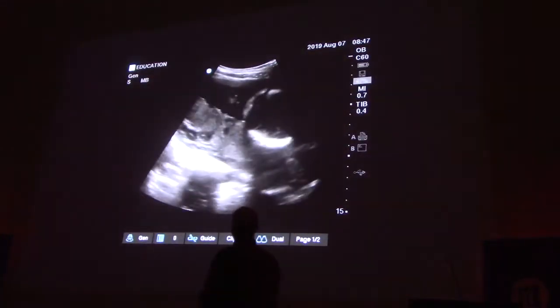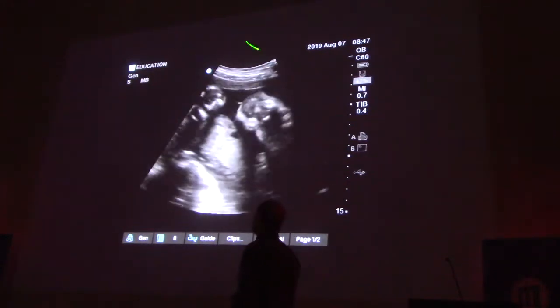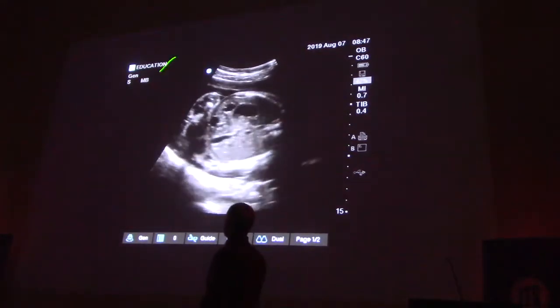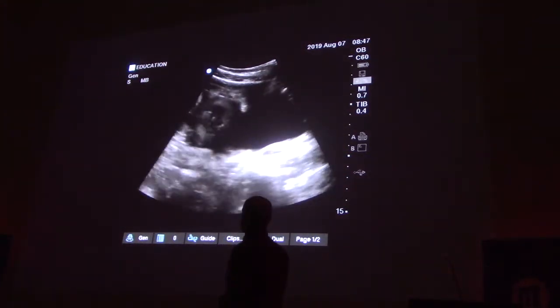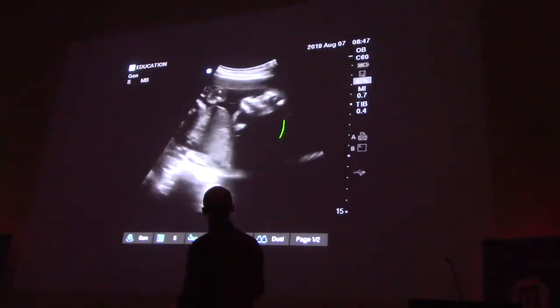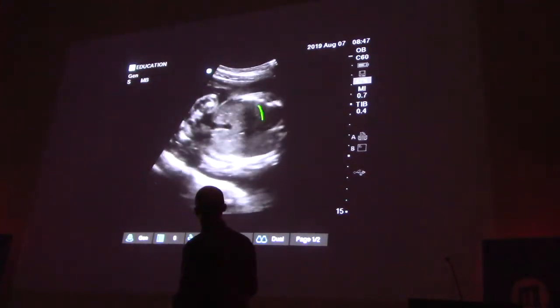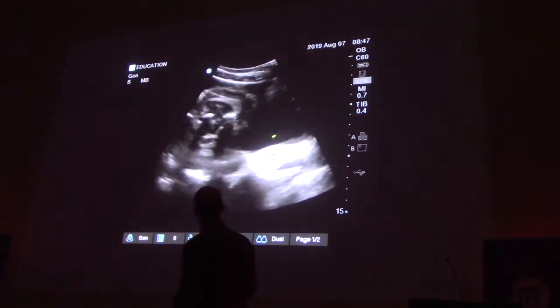Another scout scan of a different pregnancy. I had a lot of luck in a sagittal view, so probe marker towards the head. So you're generally going to have the fundus of the uterus up here on a lot of my images. And as we scan through this, I think this is a 15-second clip, we see placenta here, sort of fundal and posterior, baby's head coming down, cardiac activity, bladder.